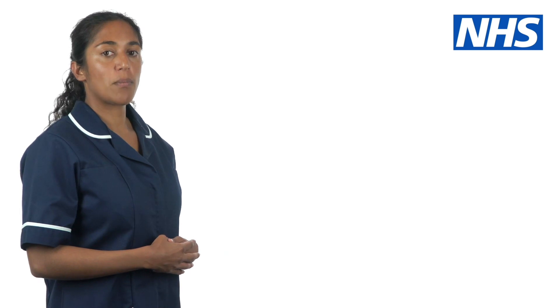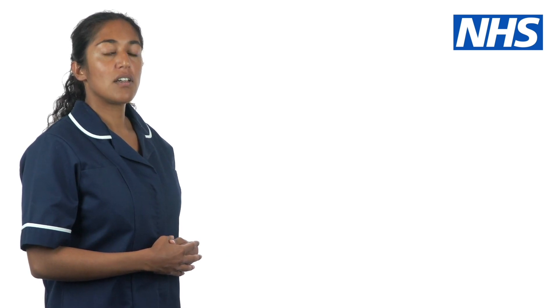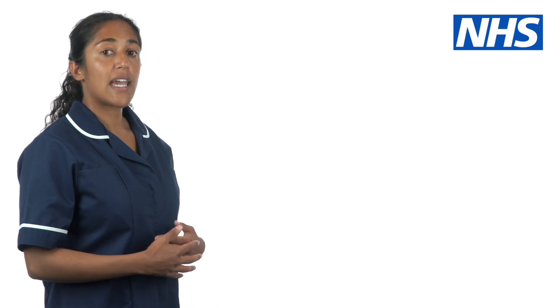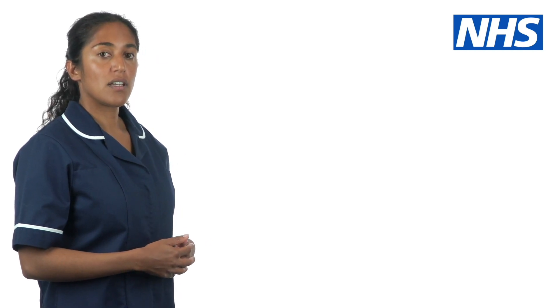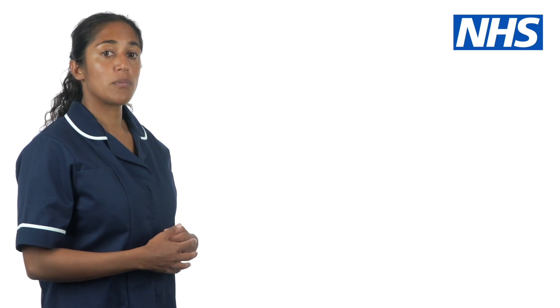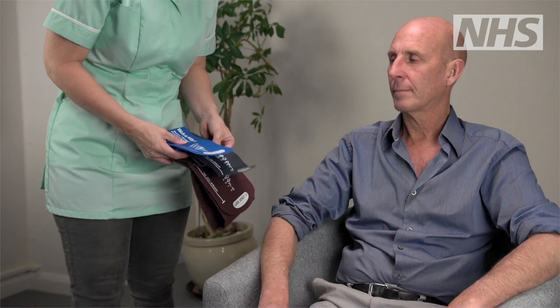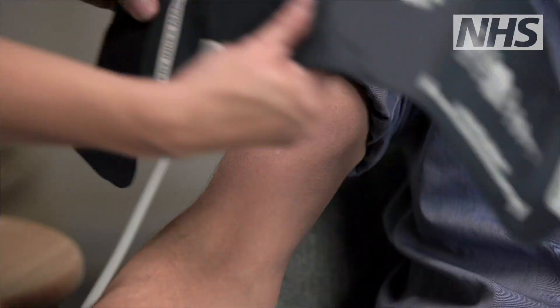Blood pressure can be measured using manual or electronic devices. To measure someone's blood pressure, gain consent and explain what you are doing. Check if the individual has a preference as to which arm to use. Select an appropriately sized cuff for their upper arm — one that will wrap around their arm completely and should not be too tight or too loose.